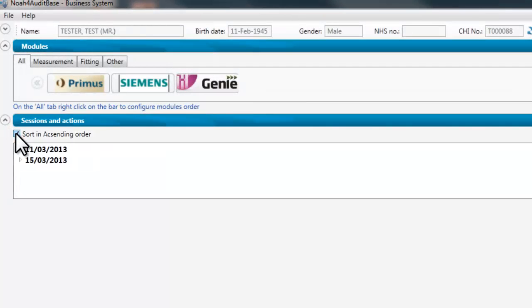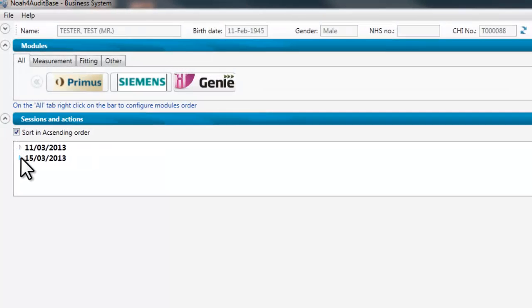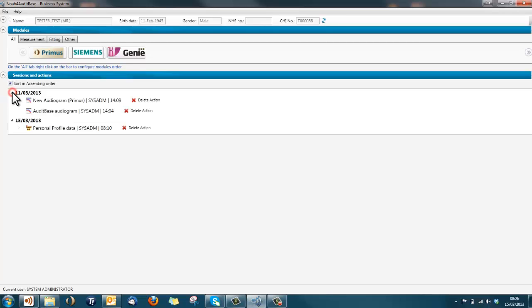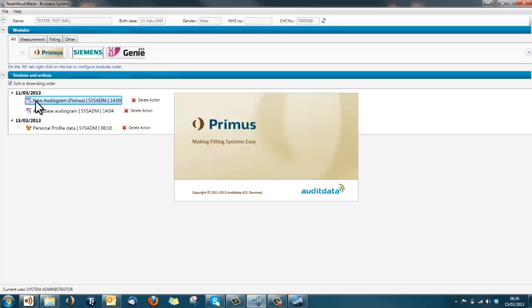Open the session of interest and the actions for that session will be displayed. Click on the action that you wish to view and the relevant module will open displaying that action.